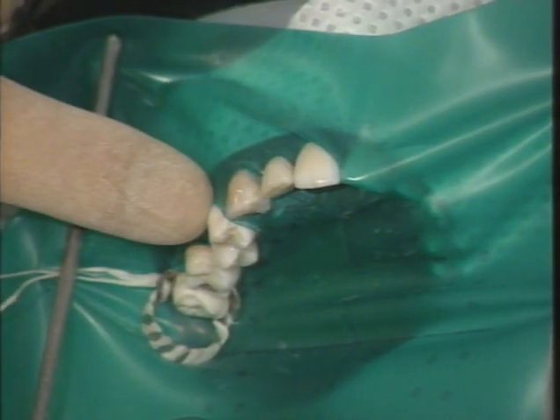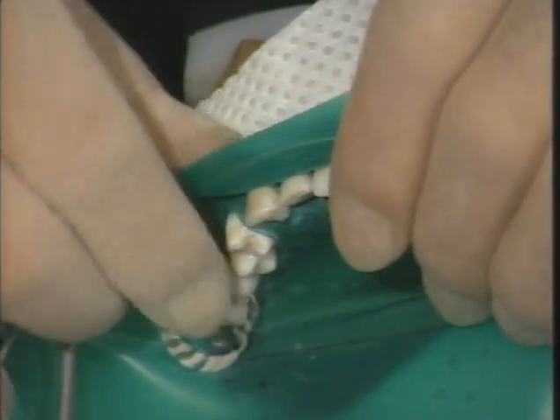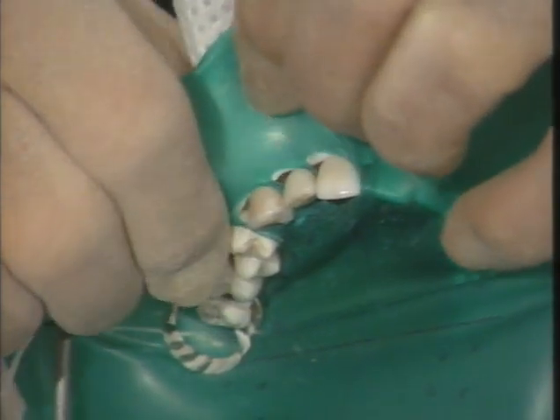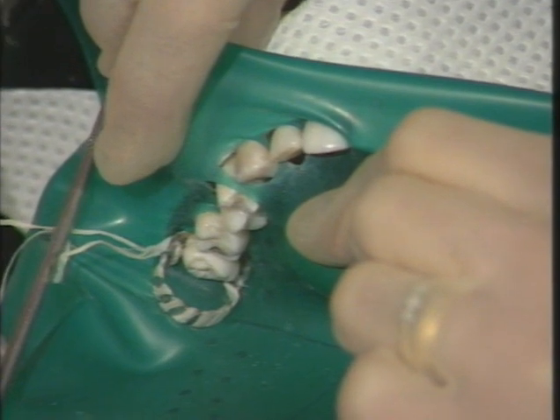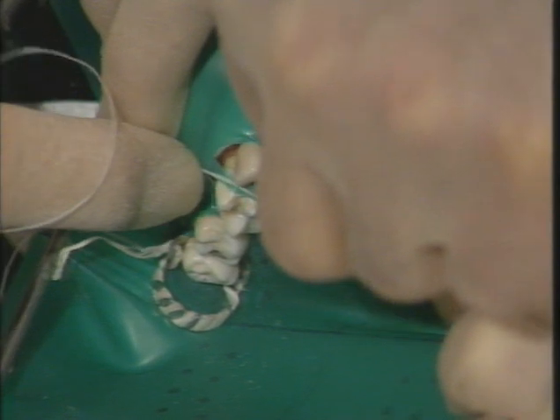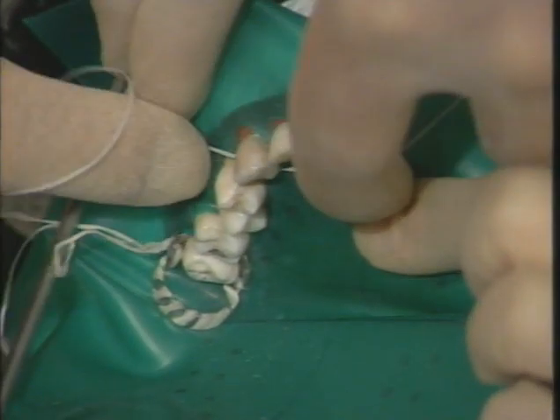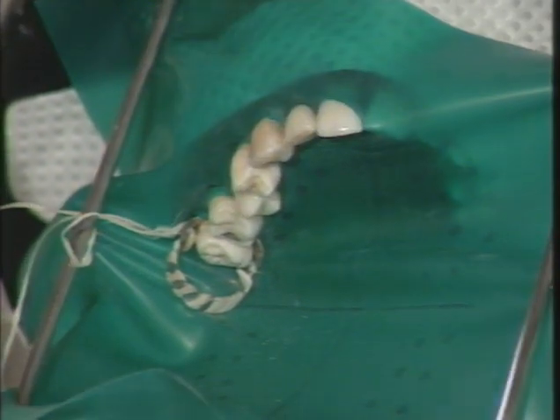You can see that the dam hasn't quite gone through one contact here, and just so that we can show you how to negotiate a difficult contact, I'll just tease it out from that position. Chris is tensioning the dam across the tooth distal to the contact so that the edge is brought on into the interproximal space, where I can pick it up with the dental tape, and by gently passing that through the contact, we get the dam into place, the tape itself then being withdrawn laterally so that the dam isn't dislodged. Once the dam is completely placed over all the teeth, the margins have to be everted so as to give a better seal.